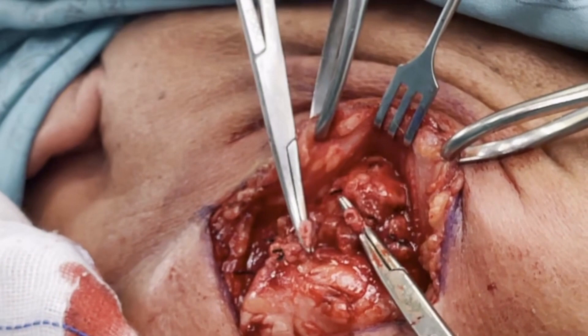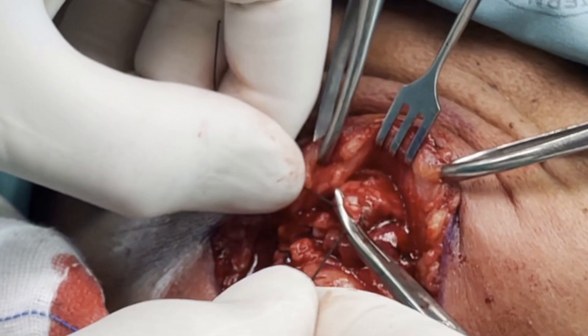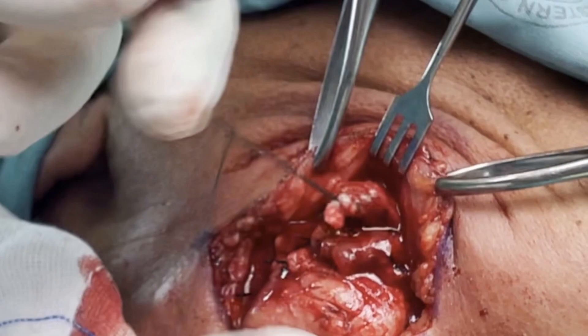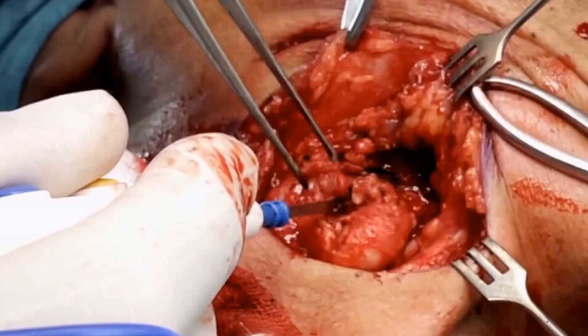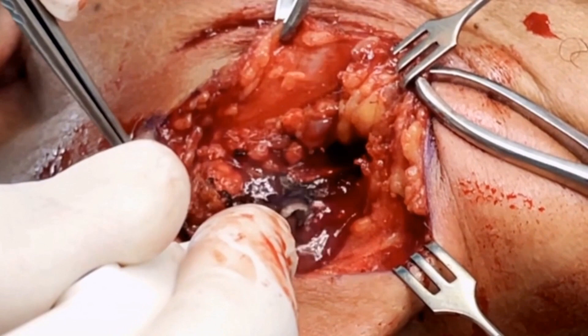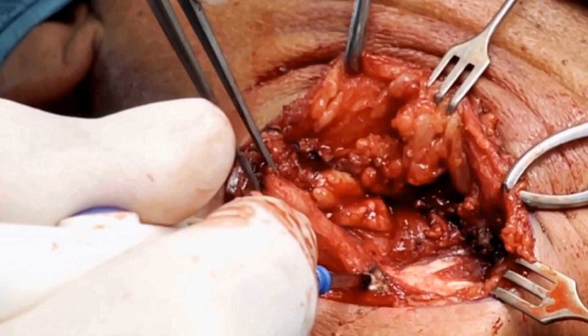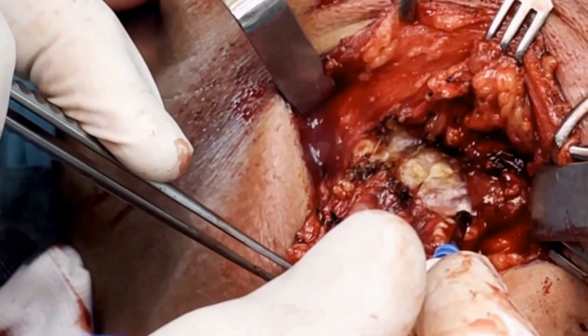When the facial artery needs to be preserved for a facial artery musculomucosal flap or buccinator flap, then one needs to omit that step and dissect the artery out of the posterior aspect of the submandibular gland. Now turn attention to the anterior part of the gland over the mylohyoid. You might get some troublesome bleeding, as shown, coming from the mylohyoid vessels. Reflect the gland off the mylohyoid to find the posterior border of the mylohyoid.